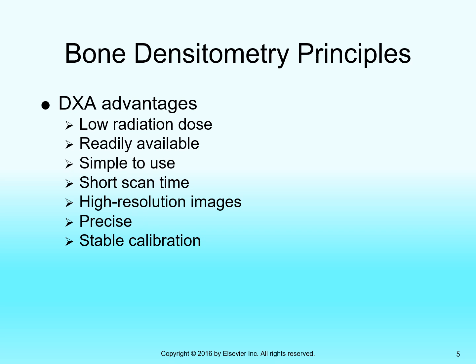It's pretty straightforward. It is measuring the strength of the exposure of the remnant beam for high energy, low energy, subtracting the difference of the exposure, and then making calculations based on the difference of the exposure. And so the strength of the remnant beam is largely based on physics and what is your energy of your X-ray beam?